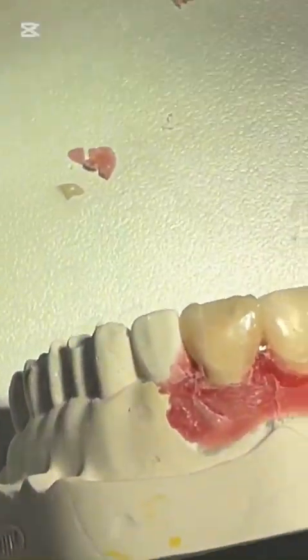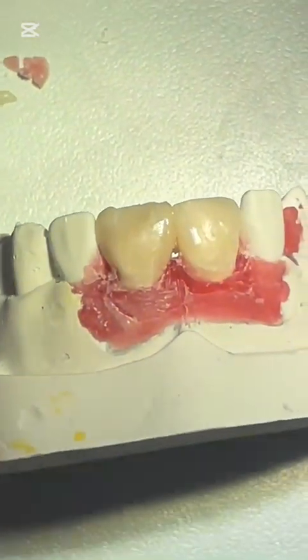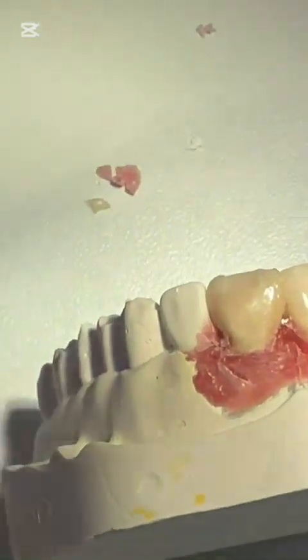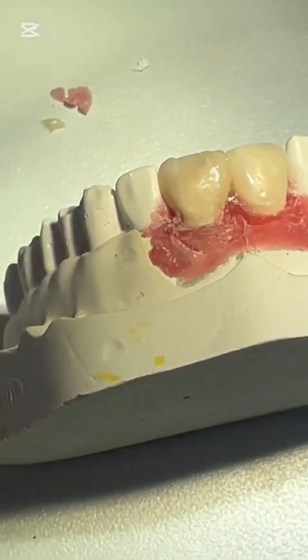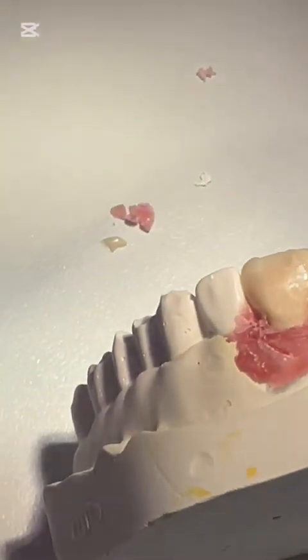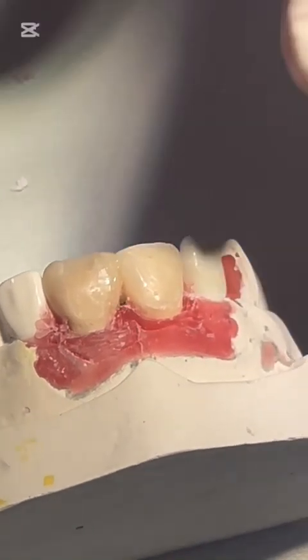An aesthetic result? No. So we need to increase the length by 2 millimeters. 2, 3. It's now 3 millimeters. Okay.